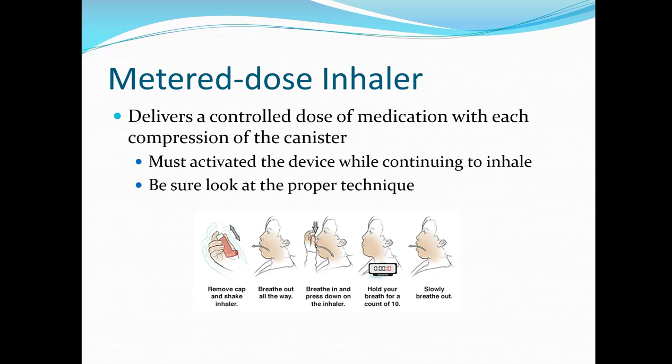So obviously, these are very common with our asthma patients. Sometimes depending on how severe their asthma is, they'll have one on them at all times. But sometimes other patients who have either respiratory failure, like COPD or whatever, may have some inhalers as well.